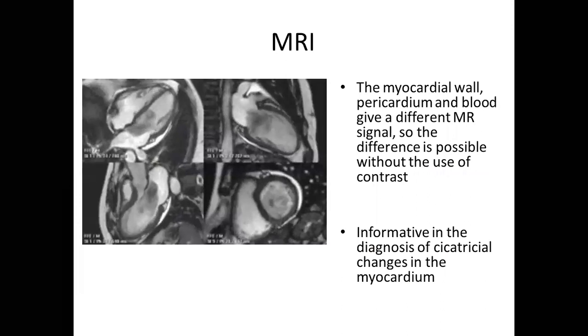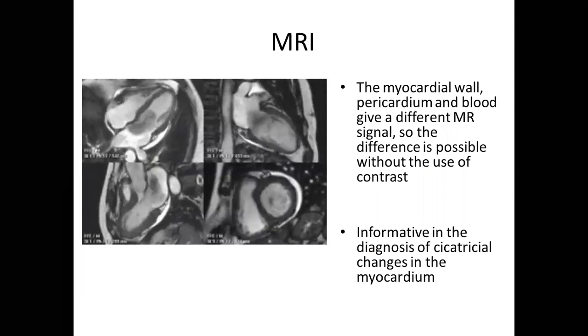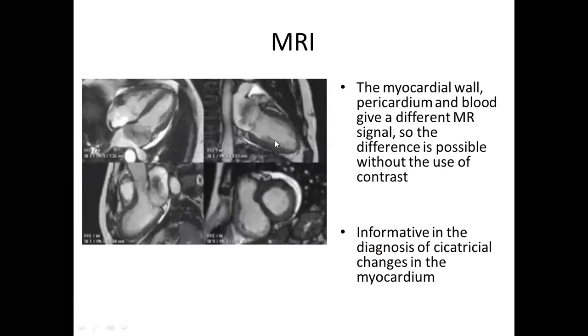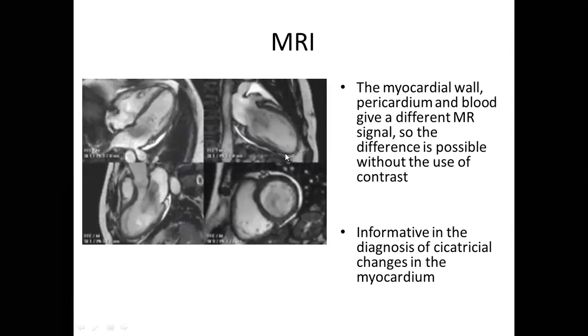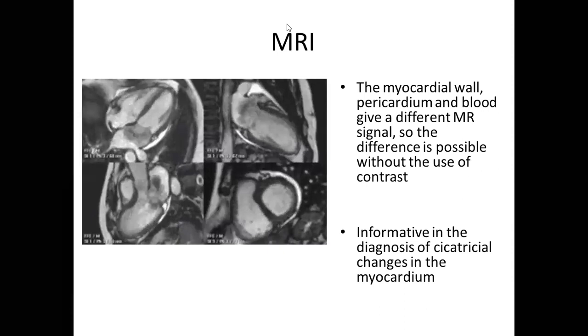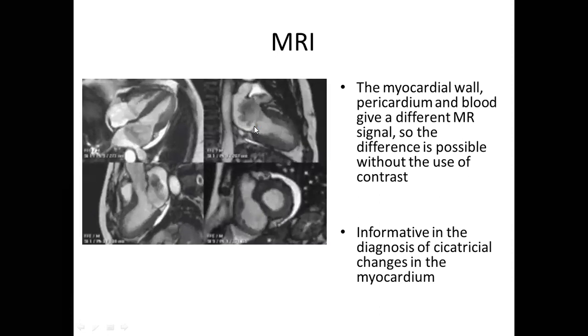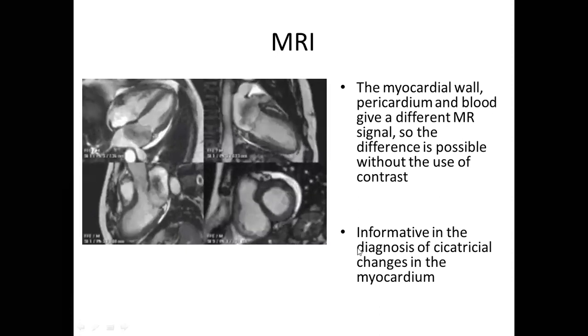This is magnetic resonance imaging. It gives us better understanding and better visualization of walls and cavities. So check out please this image. You can see these darker walls which have less intense magnetic resonance signal. However, the cavities filled with blood will have higher magnetic signal from it. And in terms of pathology, stop the video and read this.